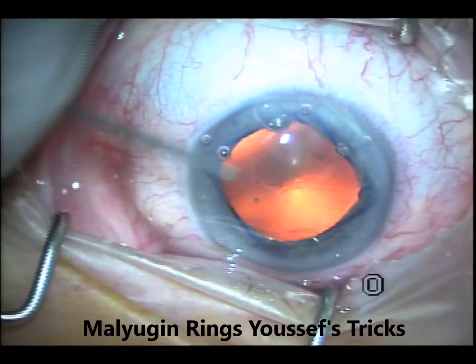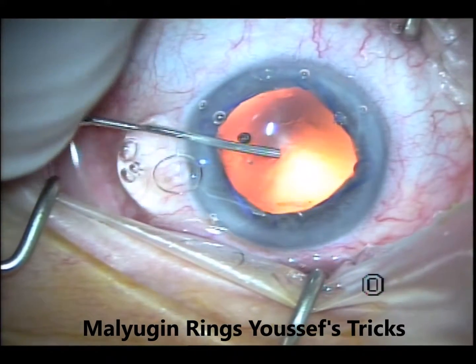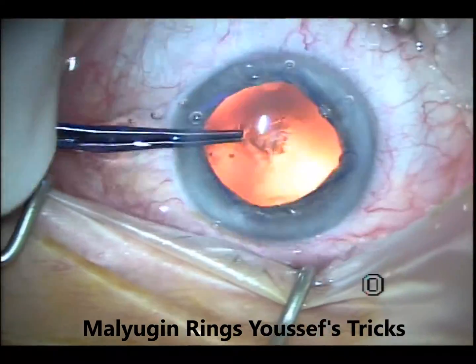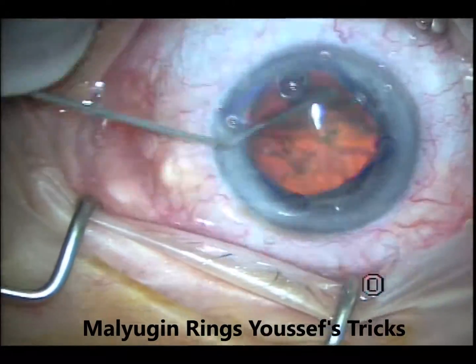This is well centered and I'll inject a little bit more viscoelastic again, because some of it gets lost. When I'm planning to use the Malyugin ring, I don't fill the chamber 100% at the beginning, because otherwise it can make it difficult for you.